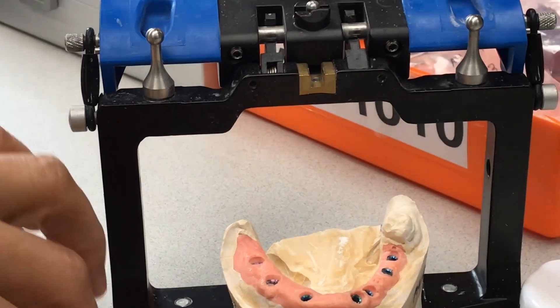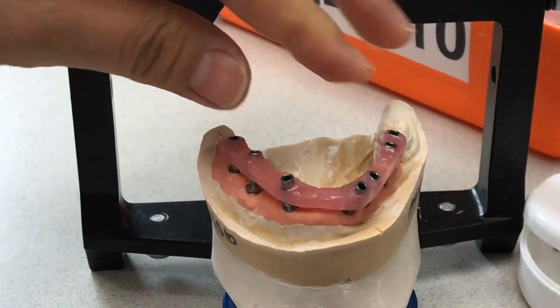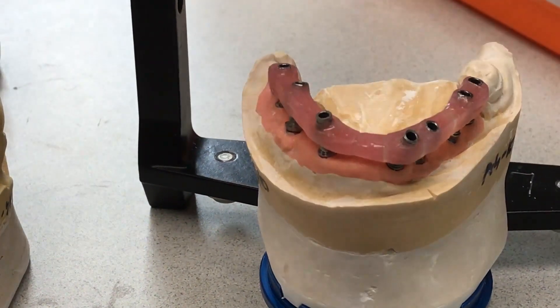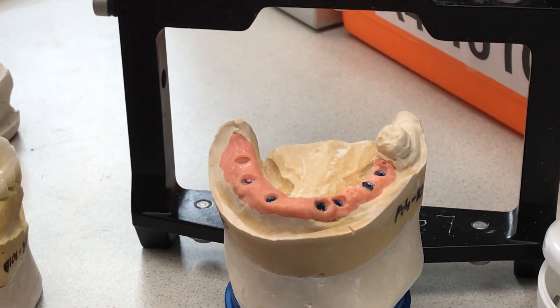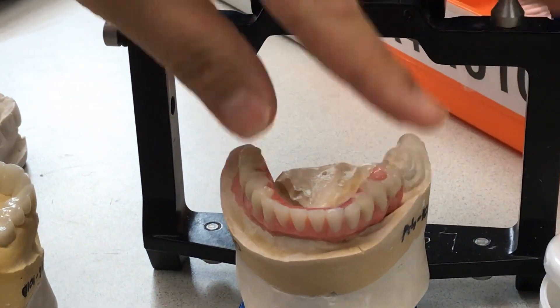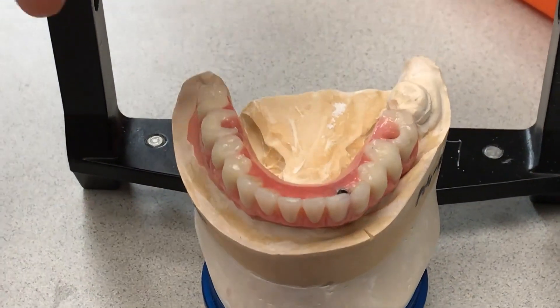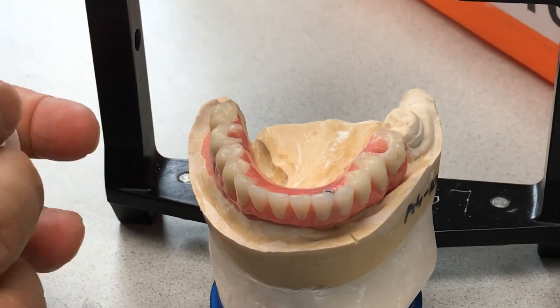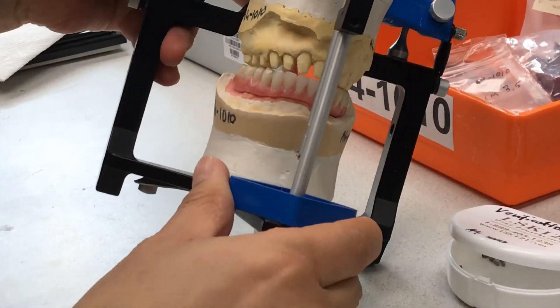Here's what I did for the dentist: we made the verification jig first, verified everything, and sent it out to the doctor's office. Then they took the bite with a bite block, we set up the wax try-in on the lower, and then using this guide we prepped the teeth.